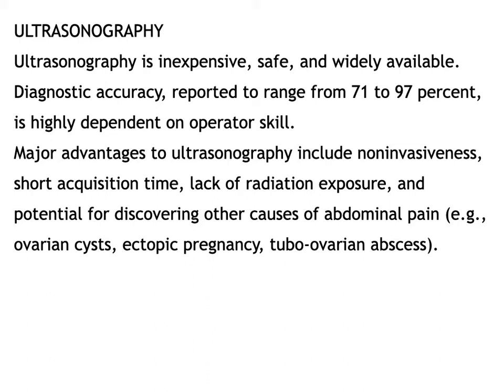And what is important with ultrasound? You can make a differential with other pathologies that are similar to appendicitis, like, in the case of females, ovarian cyst, ectopic pregnancy, ovarian abscesses, also PID, pelvic inflammatory disease, or in the case of males, we can also rule out renal colic. You know, there is this ureteric calculus which can produce severe renal colic on the right side and produce this kind of pain. Also, any type of localized bowel infection like ileitis can also mimic appendicitis. So with the ultrasound, we can rule out all those kinds of diseases and also many more. Well, these are the most important ones.